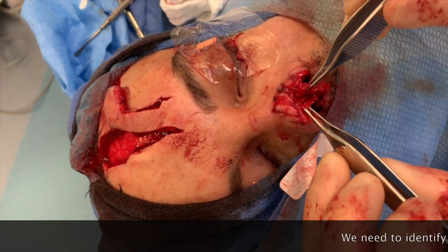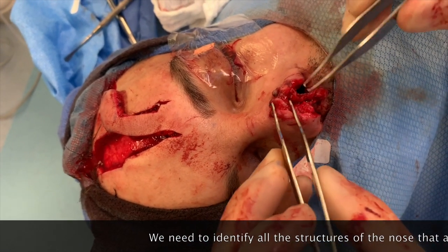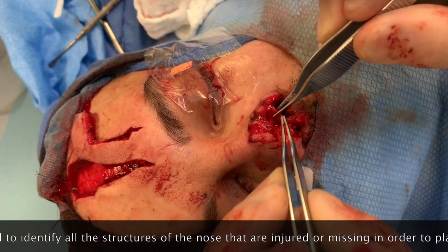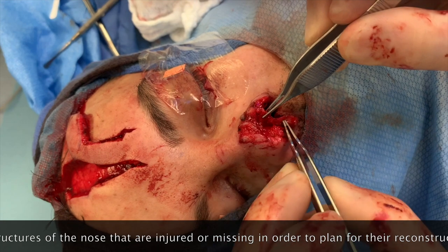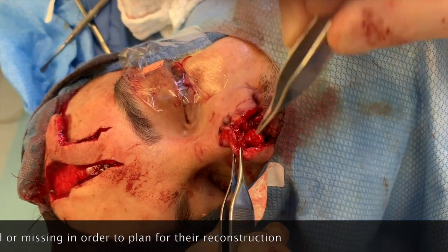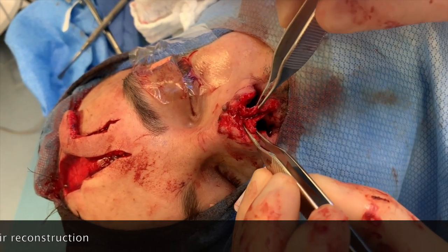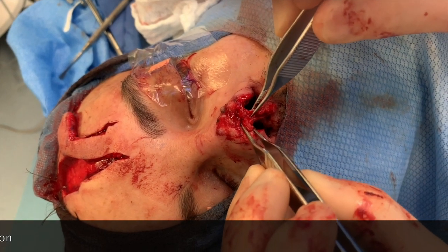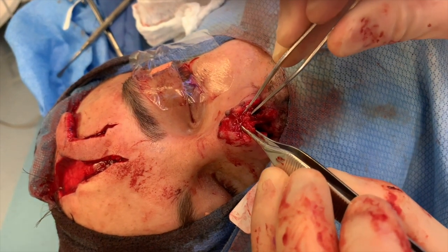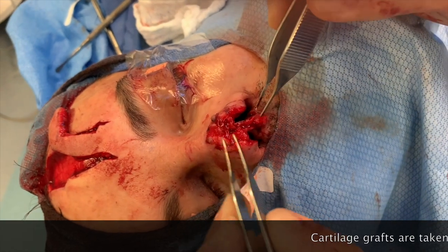We've dissected the cartilage to find out what was missing and how it was still attached. You can see that this cartilage arch goes here, but the hole from there down to the columella is all missing. The other dome is here, and again it's missing. What we're going to do is put that strut cartilage graft in between, then reconstruct these two domes, and after that put that piece of tissue back.